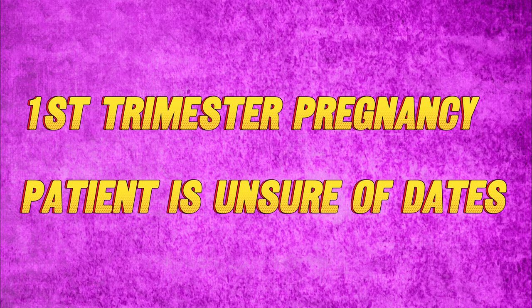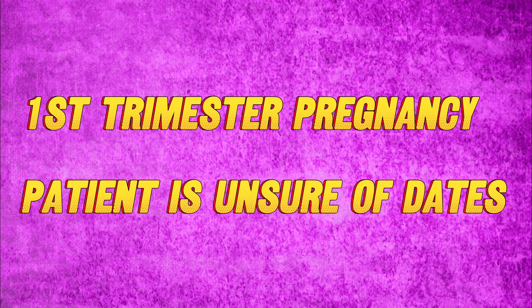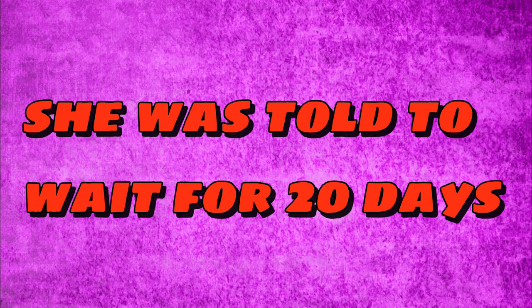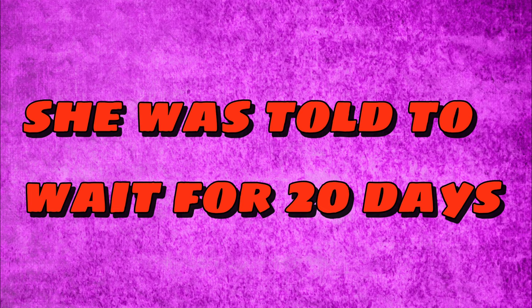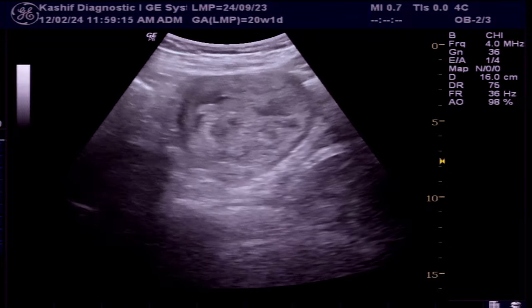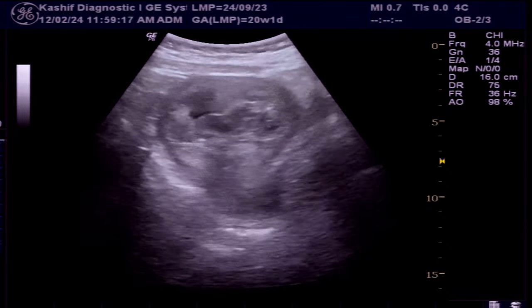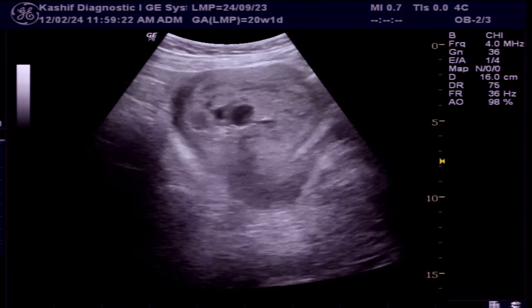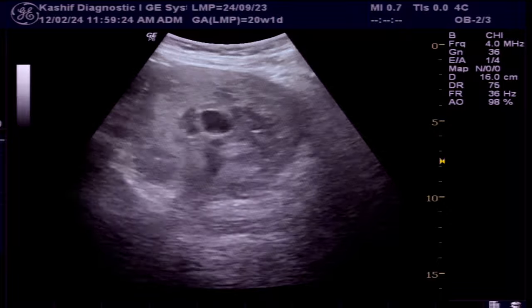Today this video is about many questions asked by patients. This patient has a first trimester early pregnancy and she is unsure of dates. There is no history of bleeding. The patient was told to wait and follow up after 20 days. She came for a second opinion, and the main purpose of this ultrasound is to assess viability and whether she should wait another 20 days.